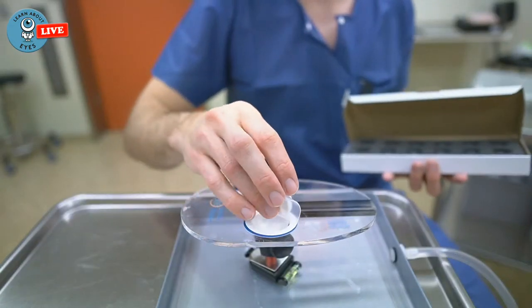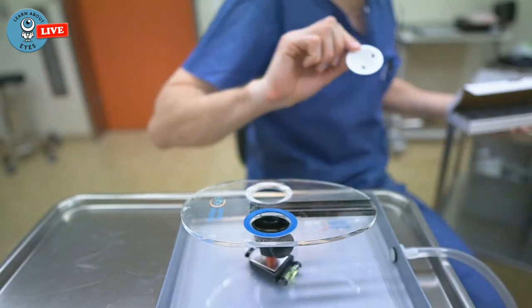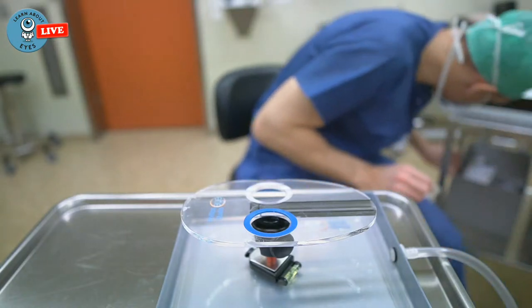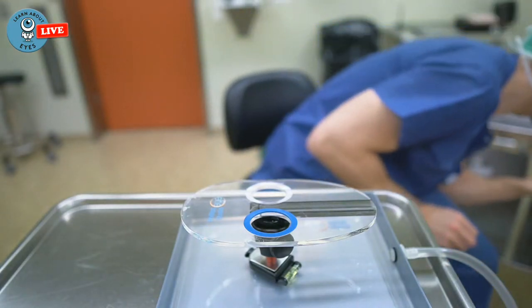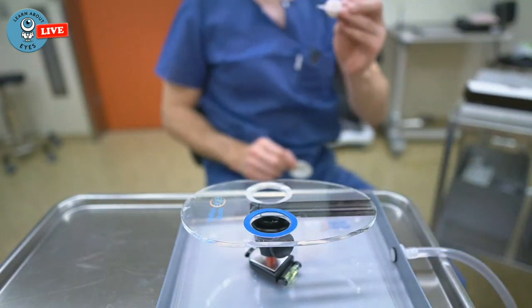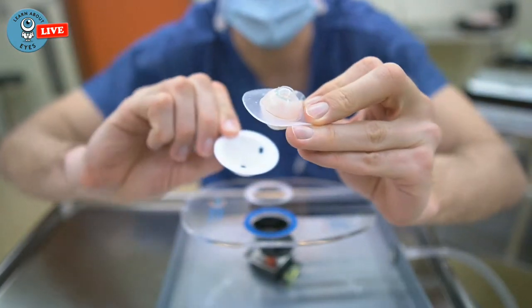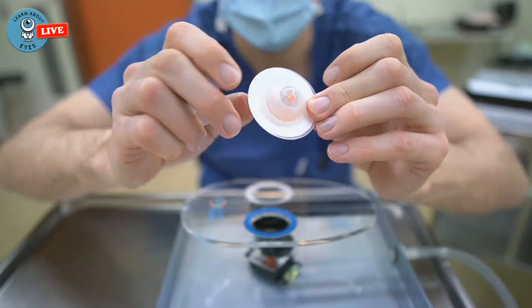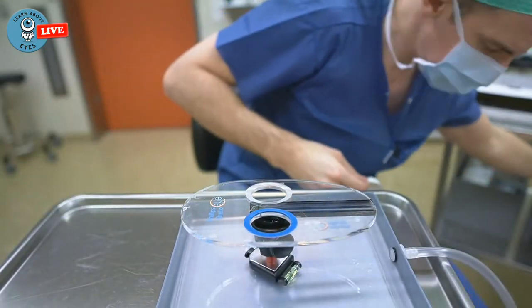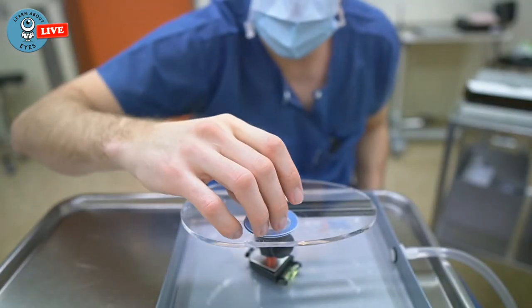Oh, by the way, I just found out for this type of eye, we don't need an eye cup. This is just for the bigger round eyes. So they do have these advanced eyes that are really round. They have a capsule and a vitreous that you can drop things in. They even have some eyes with muscles that you can pull through these holes. But we're using the cheaper ones that are solid, so we're just putting them on here.